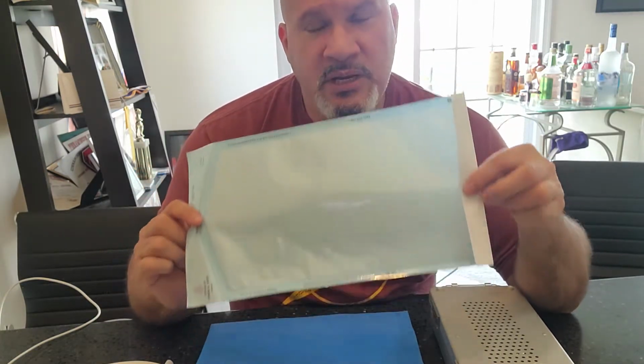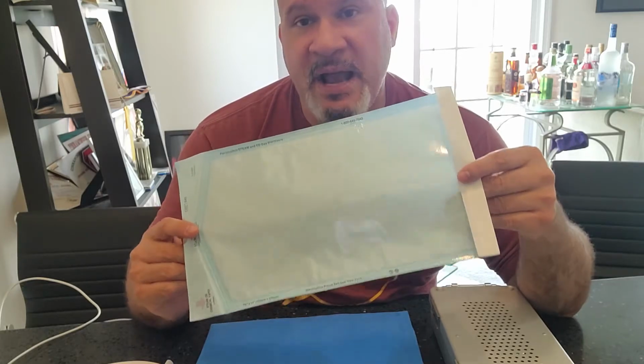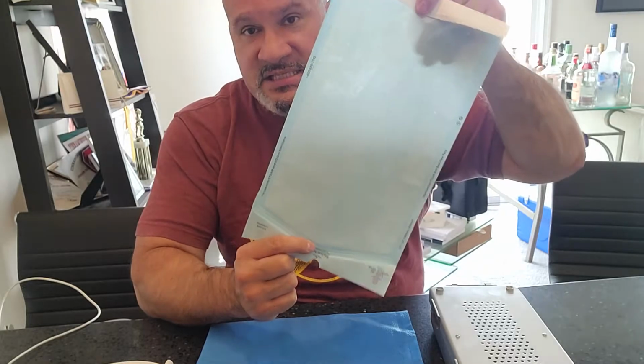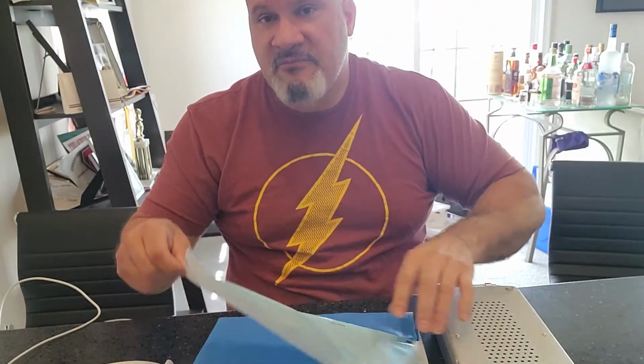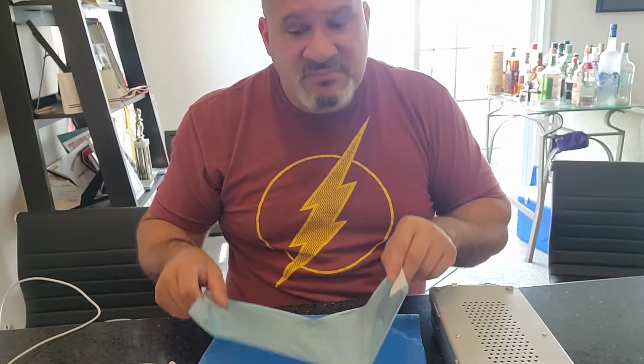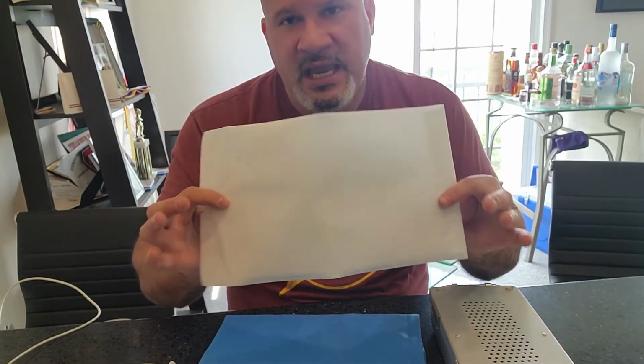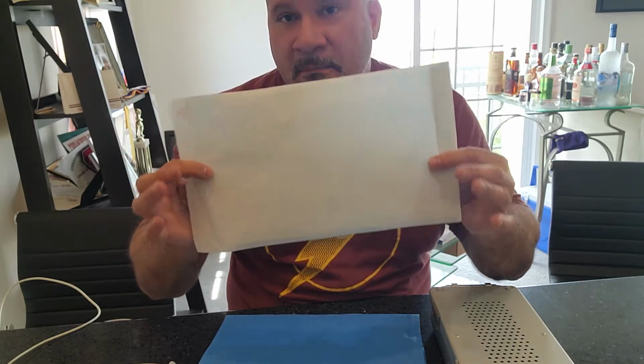Okay? The only reason you don't put a mallet in a peel pack is because of its weight. If you hold the peel pack as such, it'll break the seams, or if placed down a little, not gently, can cause a hole in the wrapper. That's the only reason why you can't peel pack a mallet.